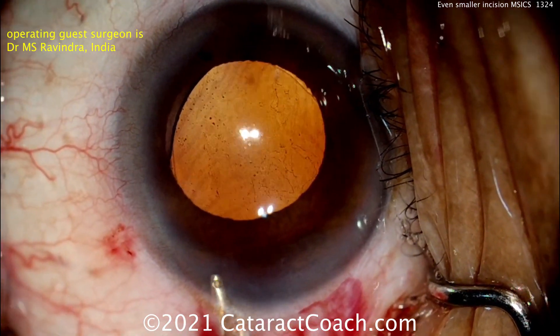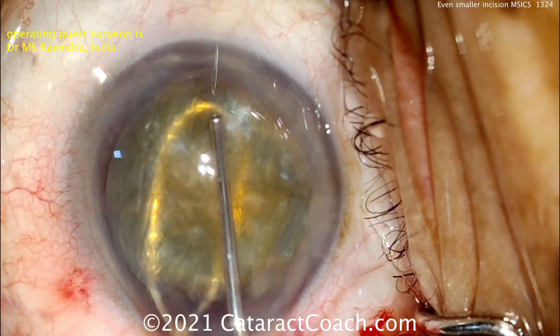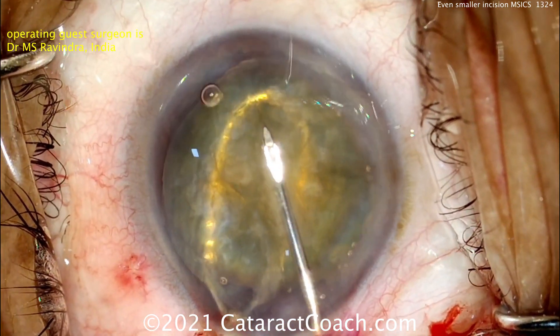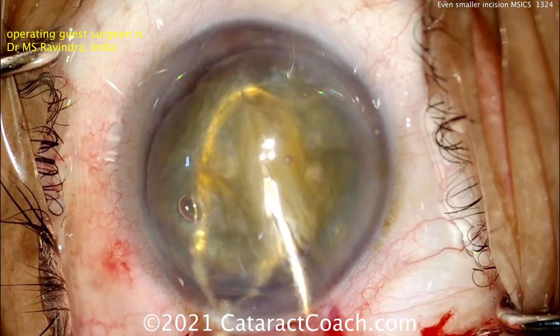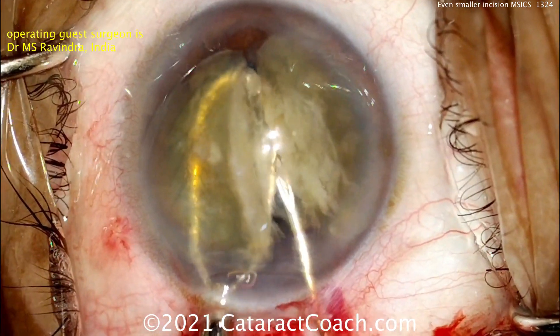And I also liked how you used the needle to cut through the nucleus. Let's watch that again — this is the important part of the case. A little viscoelastic on top to protect the cornea and create some space. Now the needle is pushing down and cutting or scoring into that nucleus right in the center of the densest part, being supported by that lens loop beneath it. And look — just beautifully split into two halves.